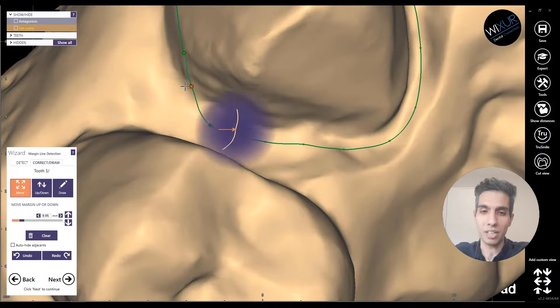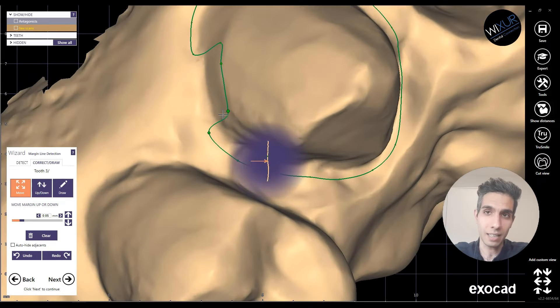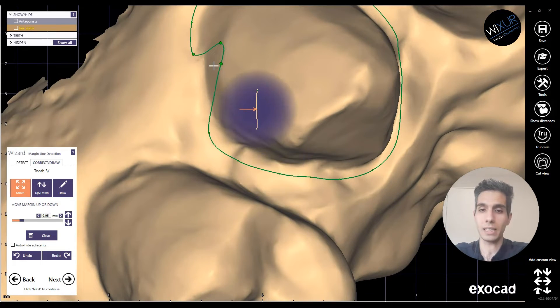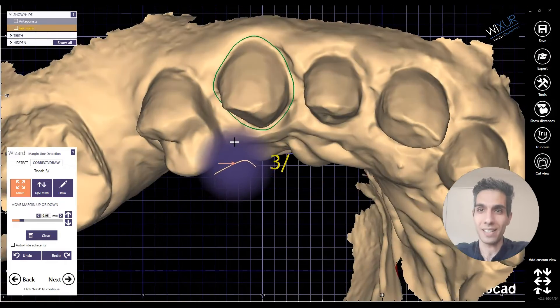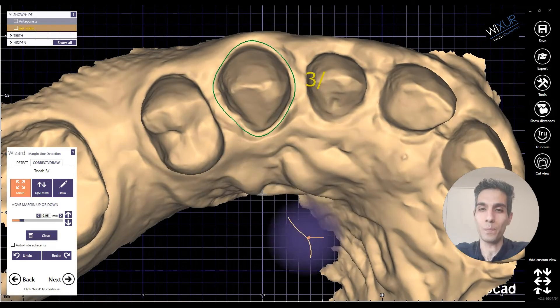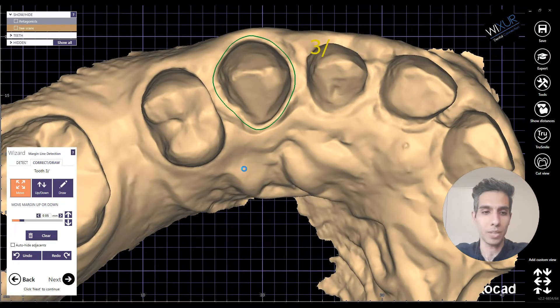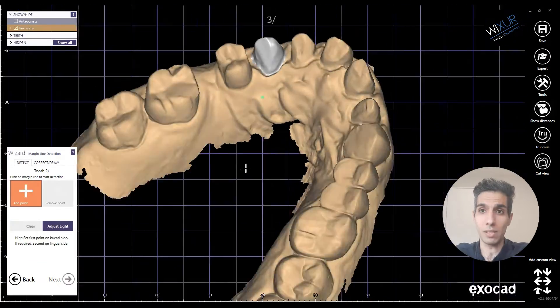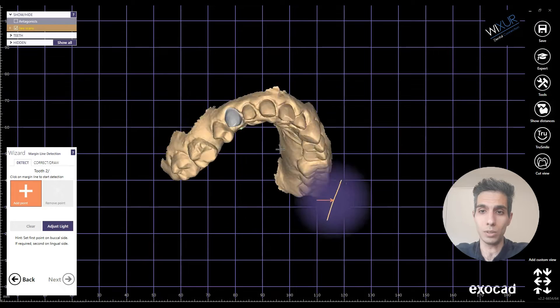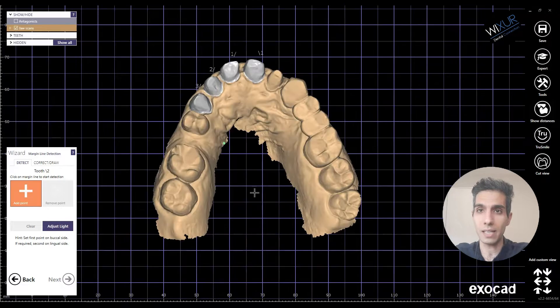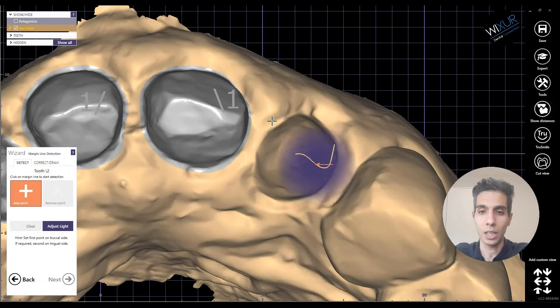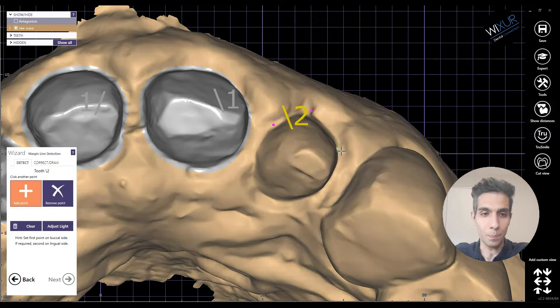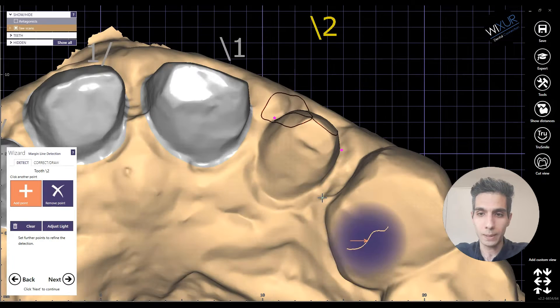This time we are going to import a face scan, align it with the TSC scan that we have here, and see how we are going to use this face scan to complete the design. Because it's the front, it's really advantageous in this case. So let's finish the margin lines.